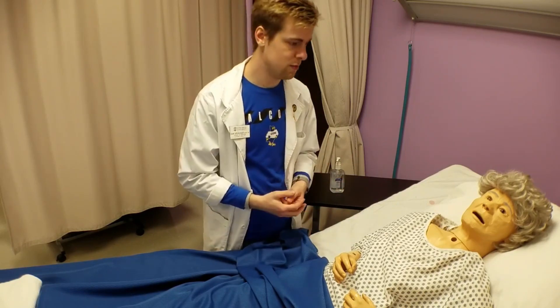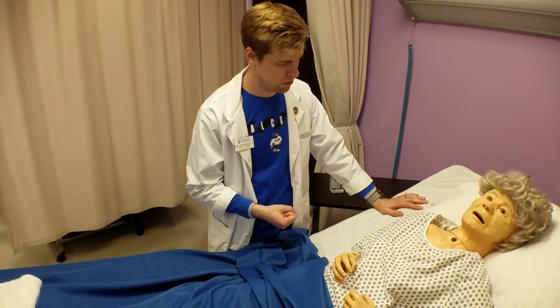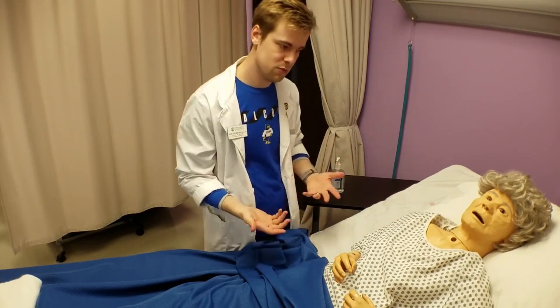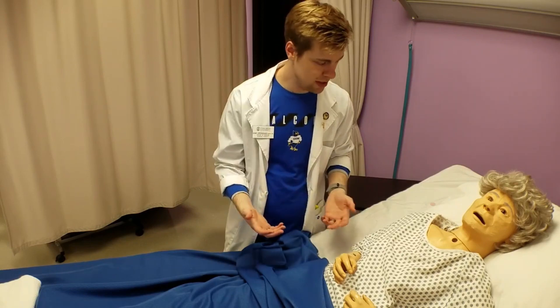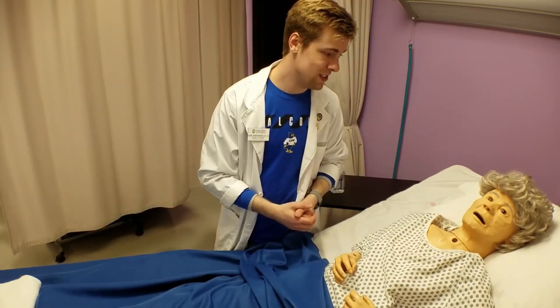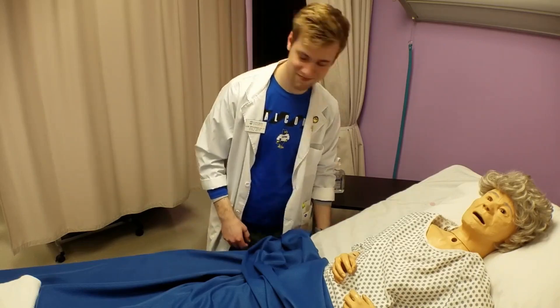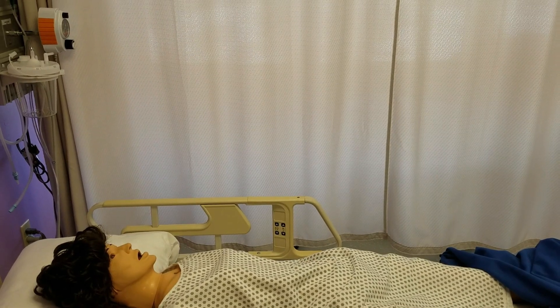Once you have identified that you have the correct patient, assess the patient's knowledge of the purpose for the catheterization and procedure to place it. Listen to the patient to identify knowledge gaps, then tailor your explanation to specifically address what she doesn't know. Plan on talking about the pre-procedural assessments, positioning for the placement, and the insertion procedure. Before beginning the assessment, be sure to provide privacy by closing the patient's door or pulling the bed curtain.